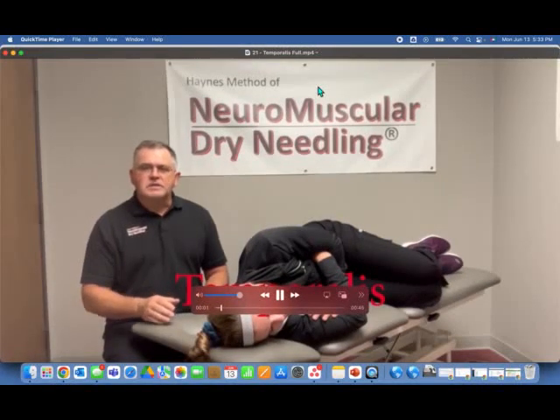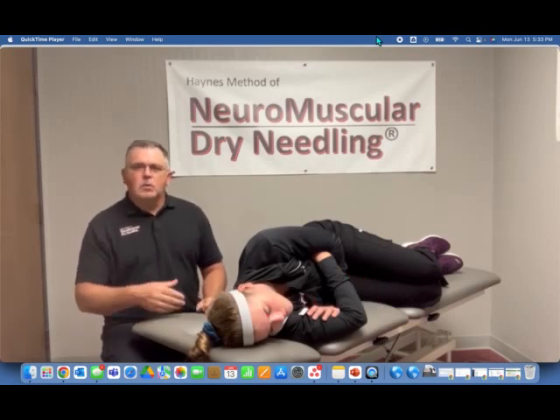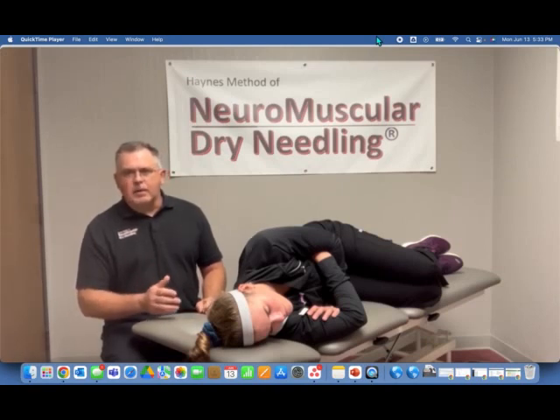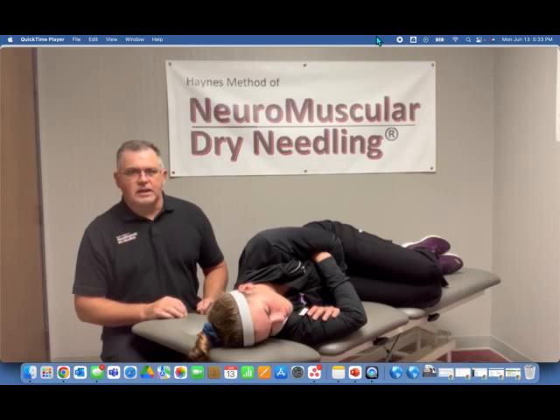For the temporalis, again, we're going to be in the sideline position using a 3 centimeter needle with a backdrop down to the temporal bone. We're going to palpate the temporal border or angle of the zygomatic bone. And we're going to needle one finger breadth superior and one finger breadth posterior to the angle in a 15-degree superior and posterior angulation.